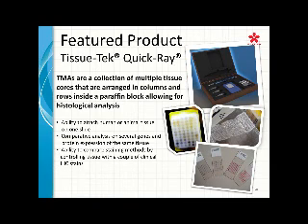Thank you. The next question is, for doing a MART1 stain, is it better to use the AEC detection system than the DAB? I prefer having both available in my laboratory. I like the DAB and the AEC. Dermatopathologists generally like the AEC, the red stain, again, because of the melanin pigment, but I've also worked with dermatopathologists that sometimes have a melanoma case and they'll request that it be done on DAB. So I don't think there's one better or worse than the other, but having both available in your laboratory is really, really beneficial.